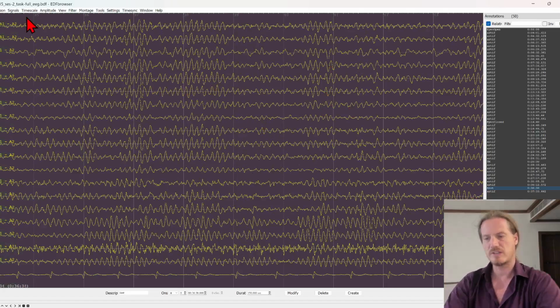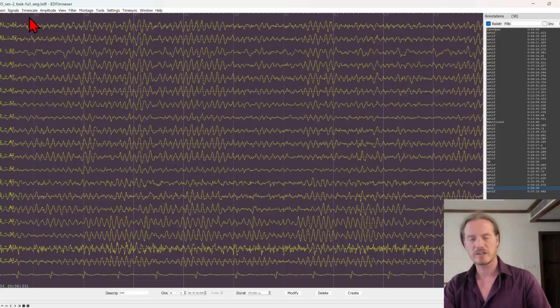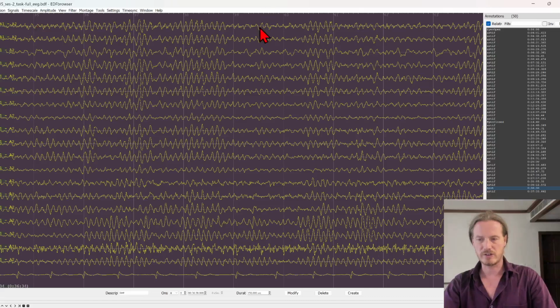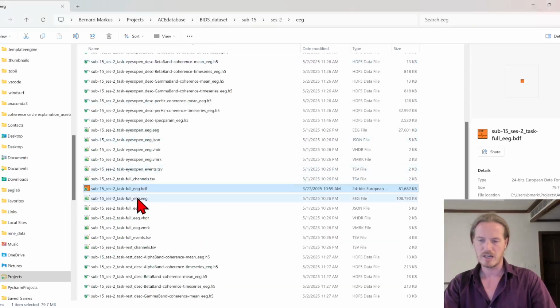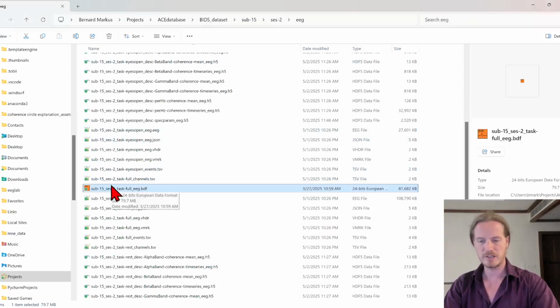So anyway, this is the raw data, which first needs to get organized, where we say which section is eyes open, which is eyes closed, which is TM, etc. We can give different tasks. And we have to manually mark when they're blinking their eyes and when they're creating distortions on the signal. That takes a few minutes, let's say 5 minutes for a whole recording, but it needs to happen, and we do it manually. After that, the file arrives in this database, and again it is separated from all of your private data.